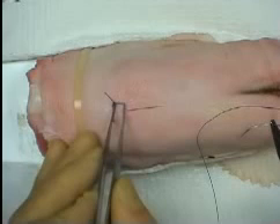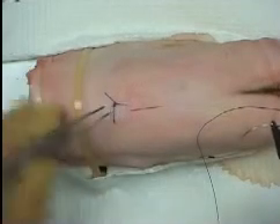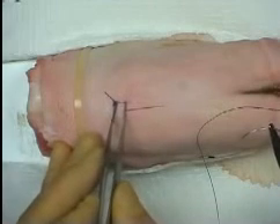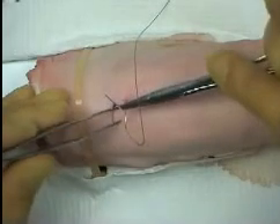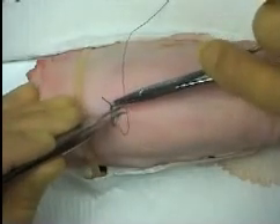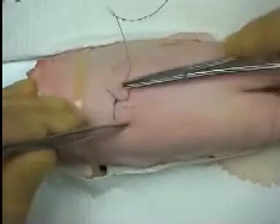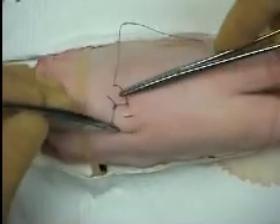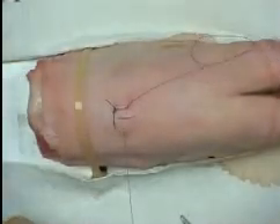To estimate the next bite placement, consider the distance of the first bite from the wound edge. The next bite should be placed at a point that is double this distance. The needle is again introduced at 90 degrees to the surface and driven along a curved path with counter pressure applied.